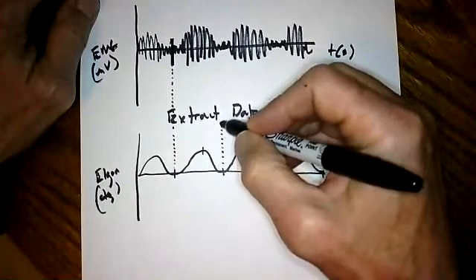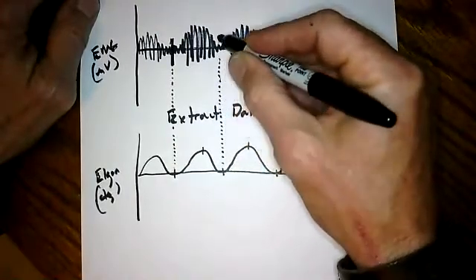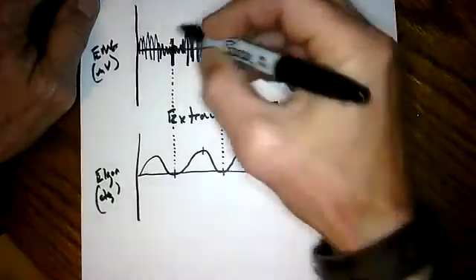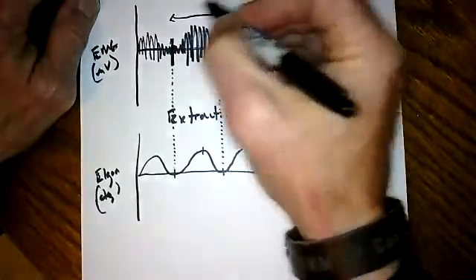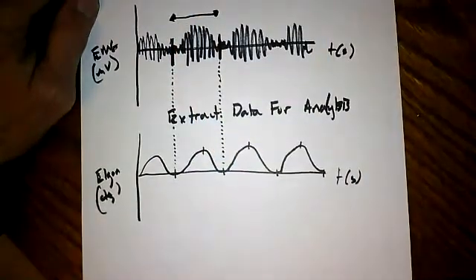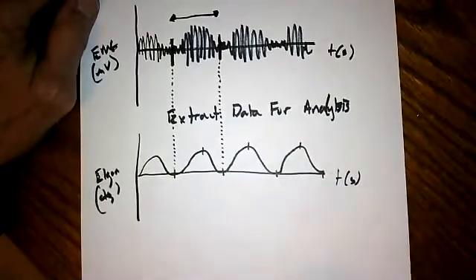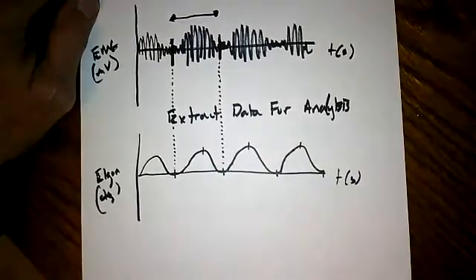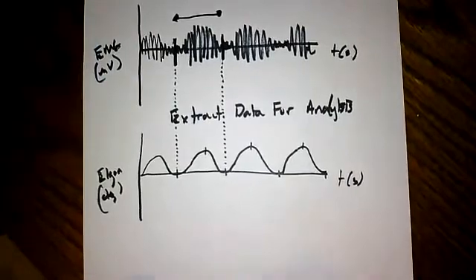And then maybe I just want to do one cycle. Maybe I want to do multiple cycles, okay? Lots of different ways you can go here. But maybe I go from min to min, and maybe this ends up being a data set that I extract for analysis. Yeah, lots of different ways. I can maybe do multiple, maybe I go 5 cycles, whatever it is. And then I pull out data for 5 cycles, something that we've been doing with swimming, for example.